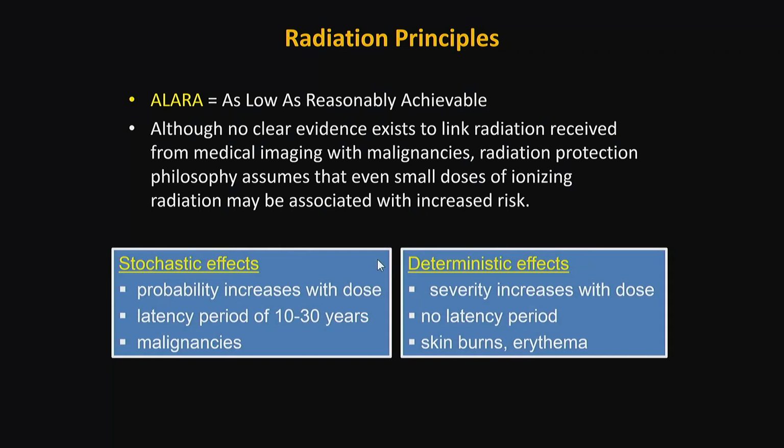Two other terms that are important when we discuss radiation are the effects of radiation, and they generally can be divided into stochastic effects and deterministic effects.